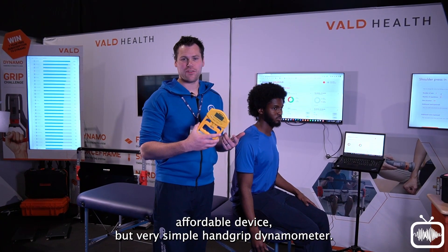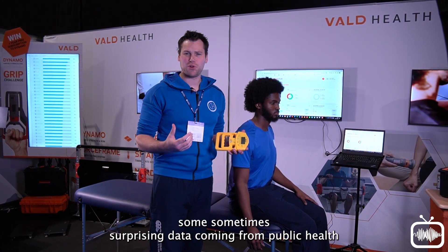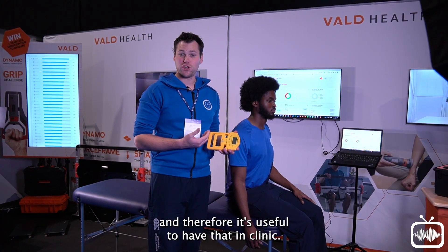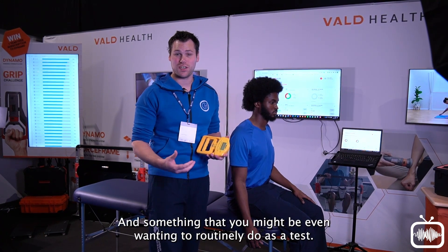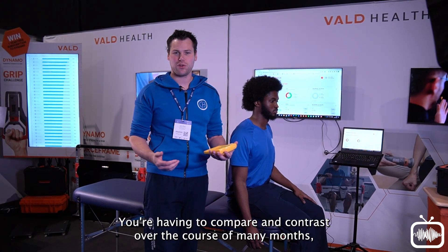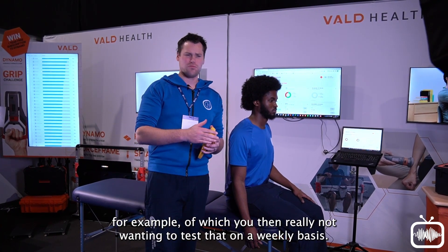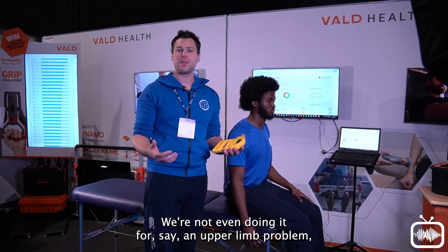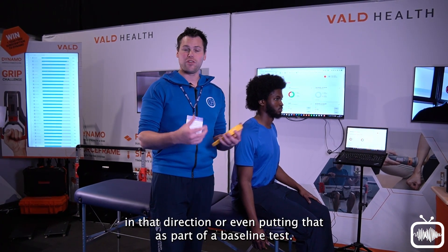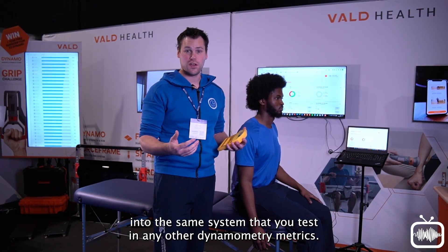This is a super affordable but very simple hand grip dynamometer — really useful for a variety of things, including some sometimes surprising data in public health, where it's quite a good indicator for all-cause mortality. It's useful to have in clinic, and something you might even want to routinely do as a test. However, that data just sits there, scribbled in notes, not aggregating properly. You're having to compare and contrast over many months — if, say, you're trying to make a change with an elderly patient. You definitely want that feeding into the same system as your other dynamometry metrics.